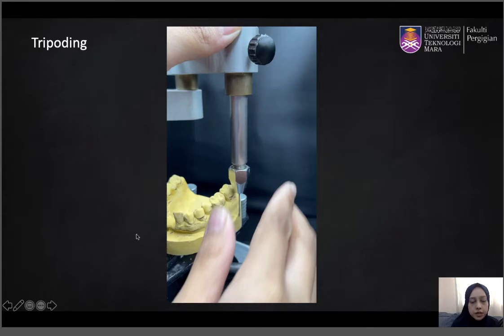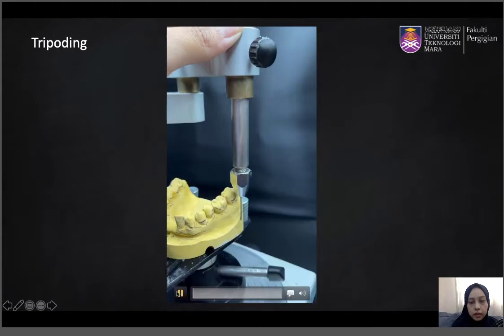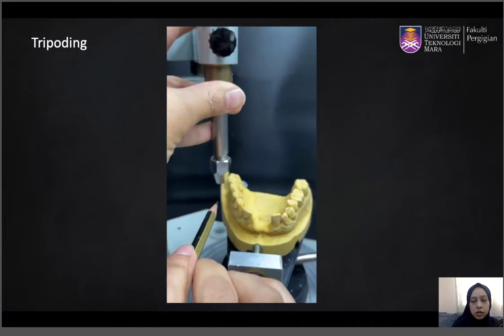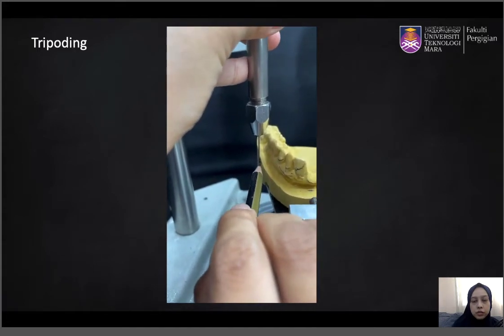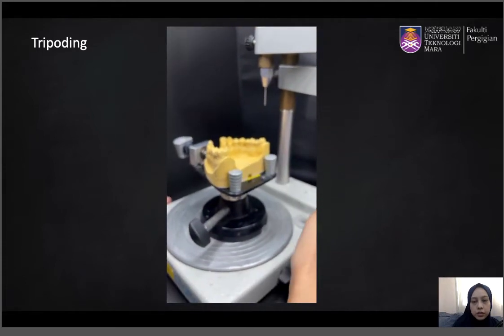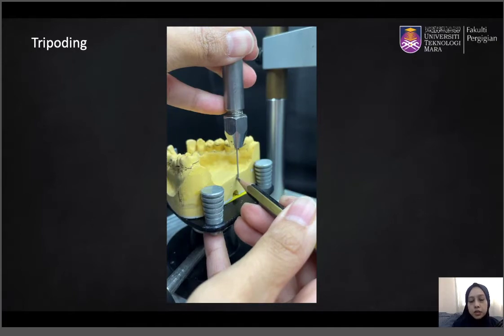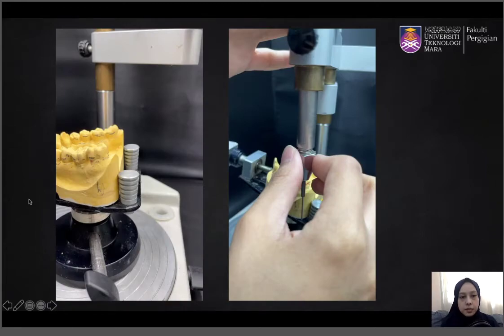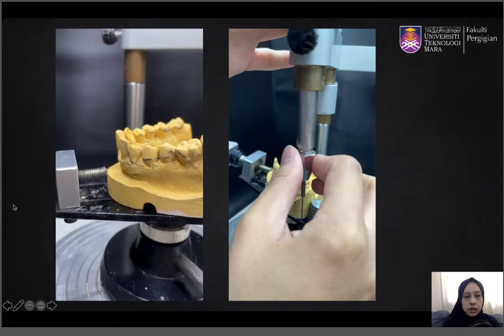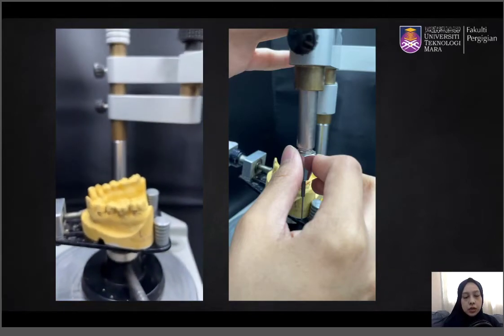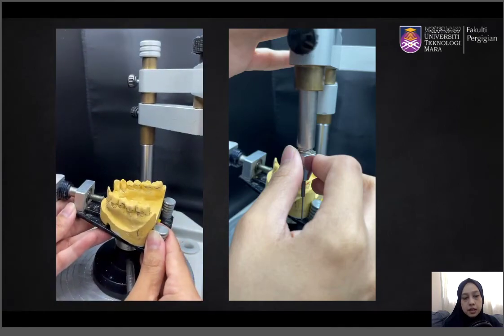After all of this has been done, you have to record the tilt by performing a tripody. Bring the analyzing rod to three different points on the cast, and all three points must be widely apart from each other. When you need to put the cast back on the surveyor, you use the tripody marks to get the exact same tilt again. In some cases where there is a deep soft tissue undercut, you may want to change the path of insertion to reduce the undercut engagement by changing the tilt.